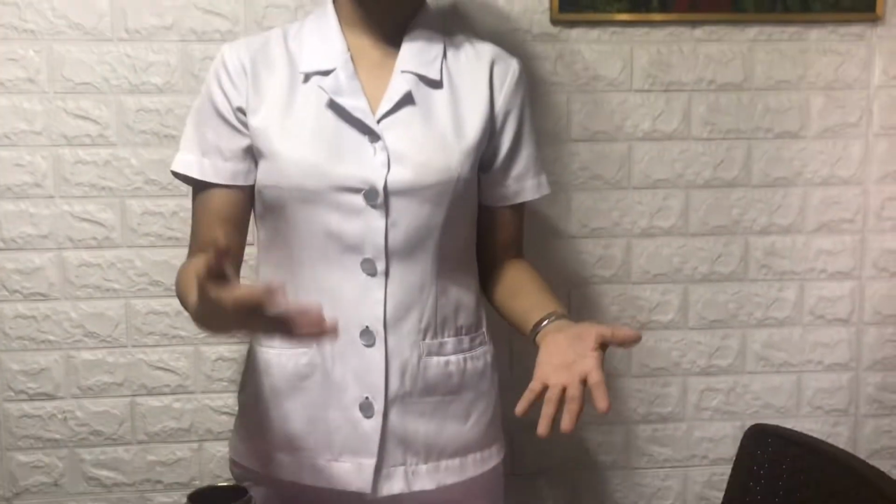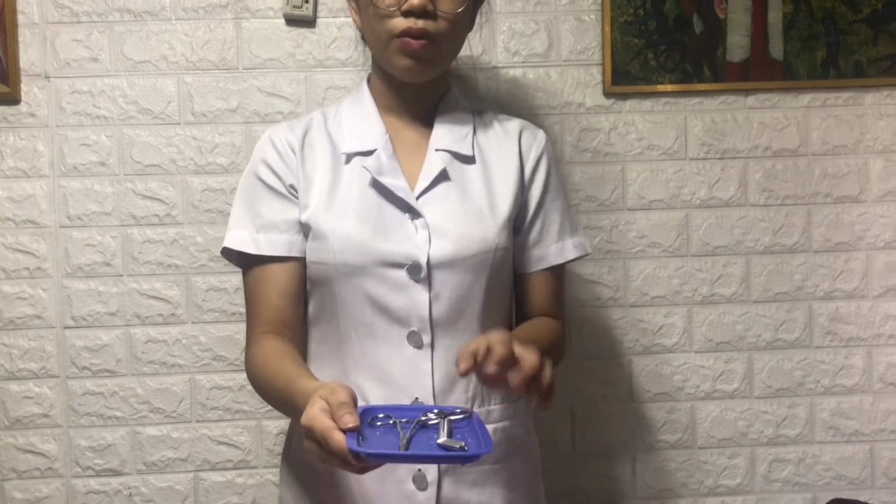Next, we need to prepare all the materials that we need. These are the materials that I will be using. First, since I don't have a kidney basin, let's just pretend and use this instead. Next are the forceps that we'll be using, this one and this one. Next is the lubricant that we'll be using for smoothing the catheter. The betadine and the cotton ball.